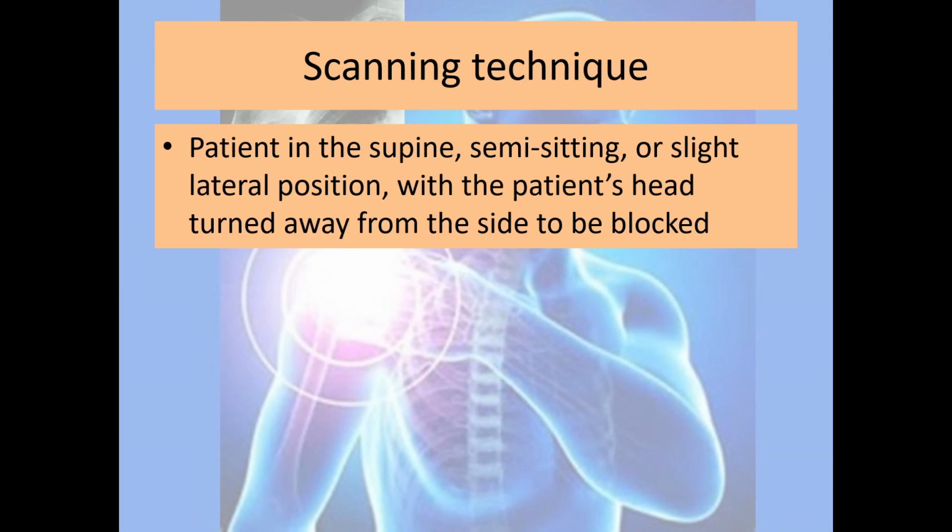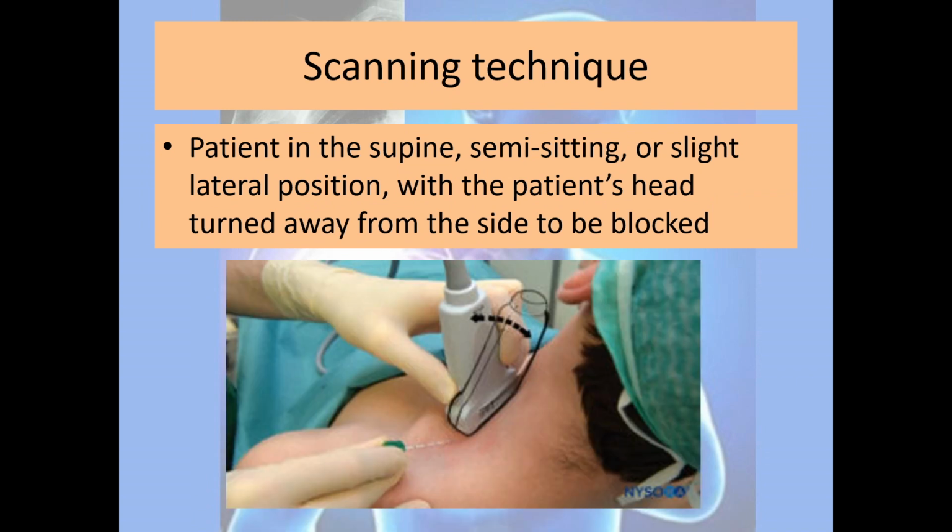But for the scanning technique, however, the patient need not be in the propped up position. You can perform the block in the supine position, semi-sitting or slight lateral position with the head turned away from the side to be blocked. Something like this.